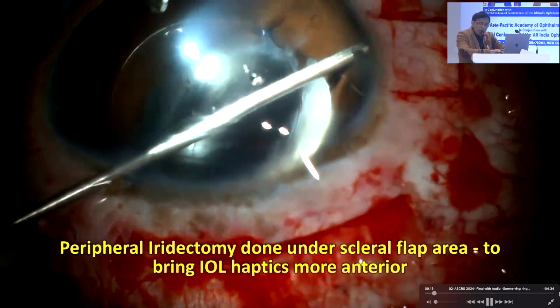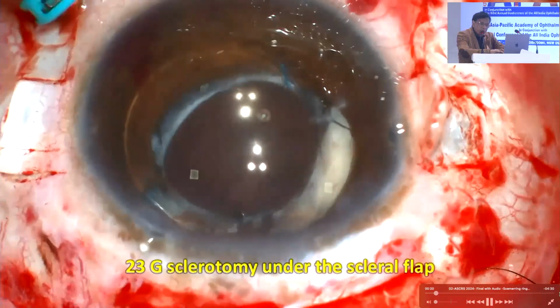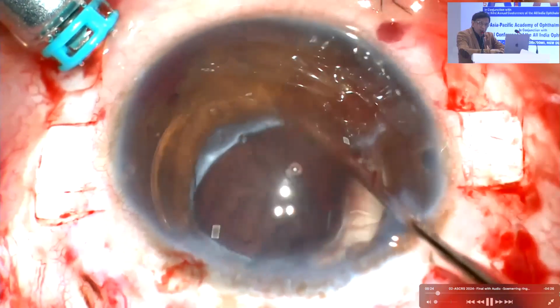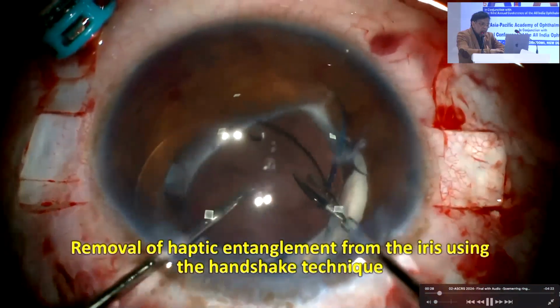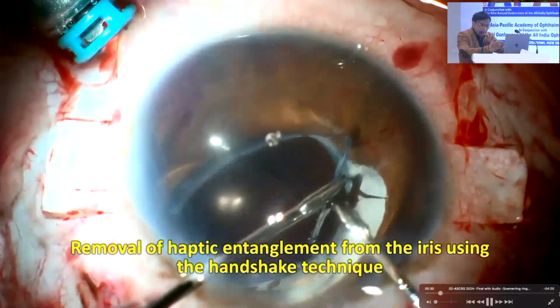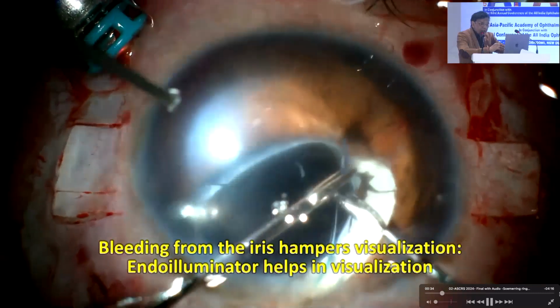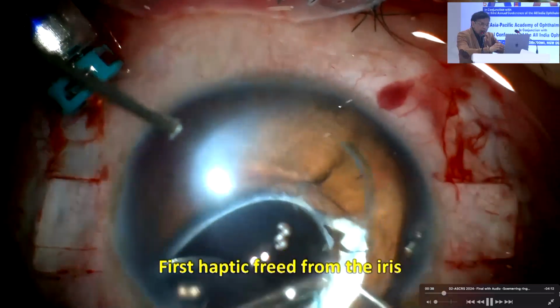You see, this is a large eye, and a trick I tell everyone here is, when you have a large eye, do a small peripheral iridectomy. The reason is, you can come more anterior when you make your sclerotomy. Now look at that IOL, it is stuck to the iris also, because I told you this has happened some years later. Now I have dislodged that haptic from the iris slowly using the handshake technique.